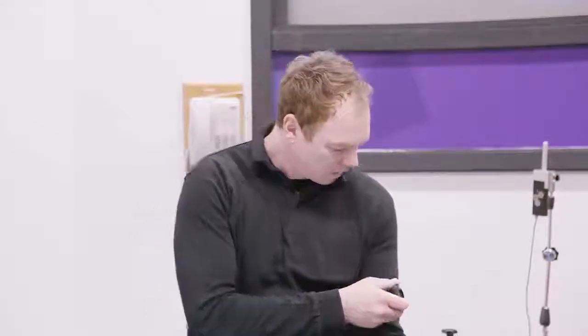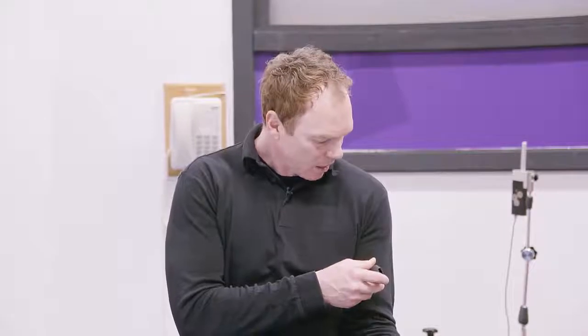does that normalise the problem? For stimulation, maybe yes, but not for the position of the sensor tip. If you have a big muscle, the position of the electrode will not affect the results all that much. But if you take the sensor tip and you put it here in the center of the muscle belly, or if you put it here, you would get quite a different result. But again, why would you put it here?